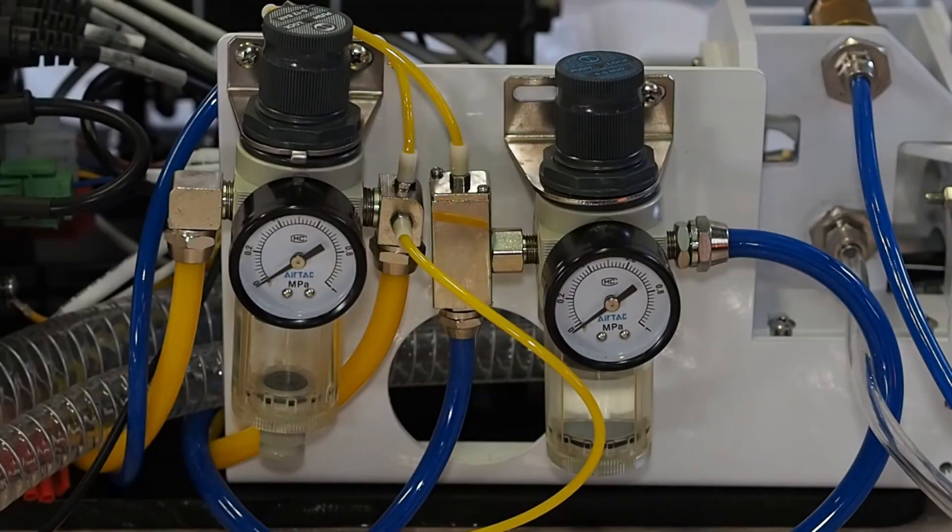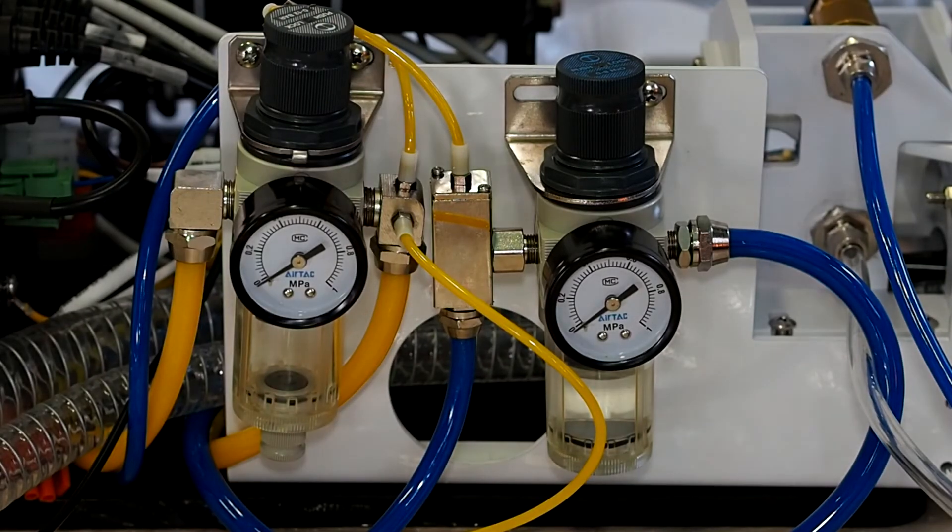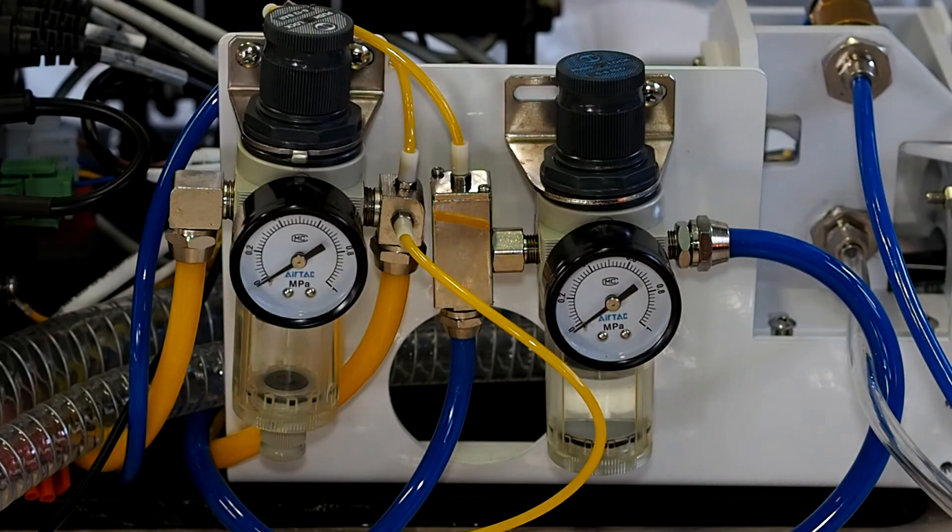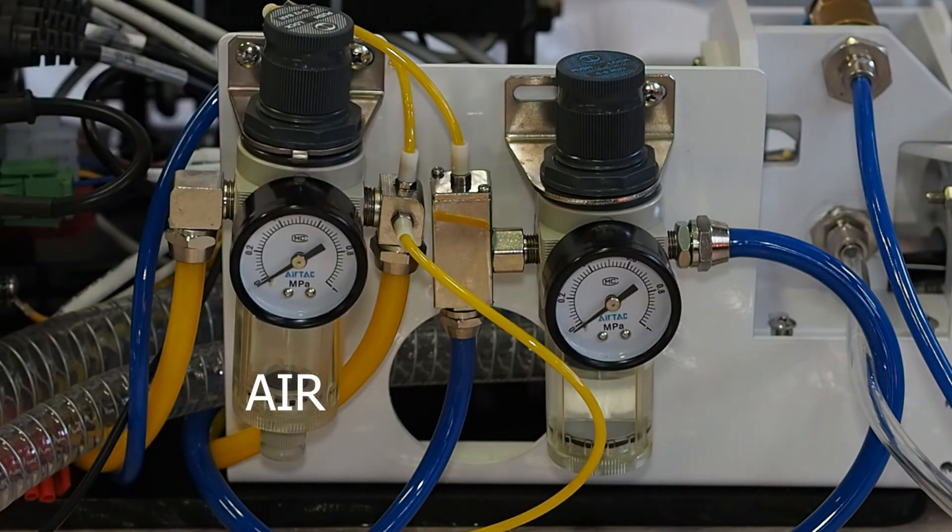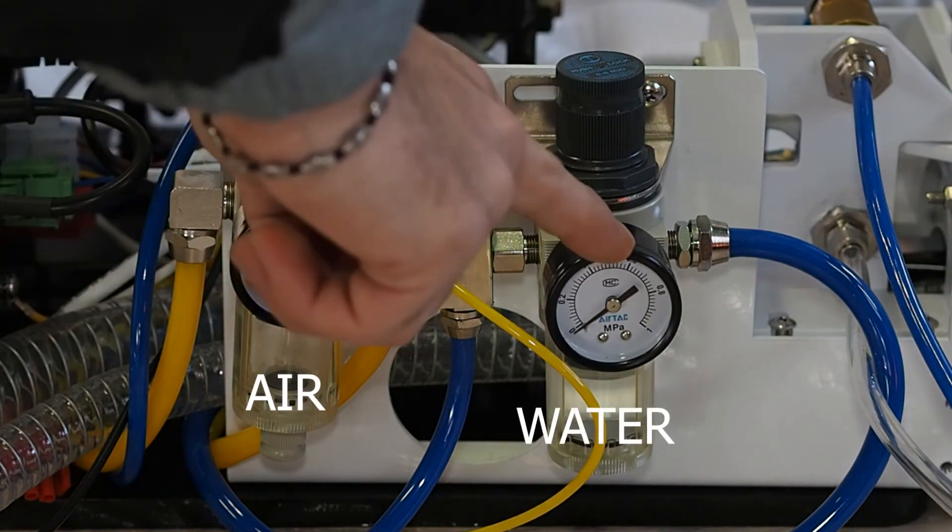The last check you can do is to see if the air or water pressure is properly adjusted. You can control it at the base of the dental unit. There are two valves. The right pressure for the air is 5 to 6 bar, and at least 3 bar for the water.